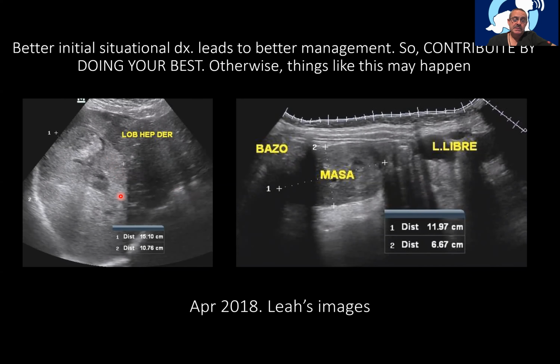We even found liver tumors, metastatic liver on her, and masses in places other than the original place. This is a subsplenic mass. That topography usually is from a lymphoid component.